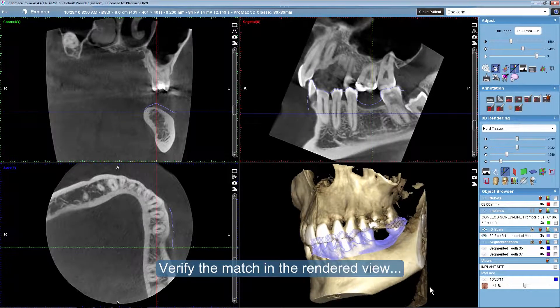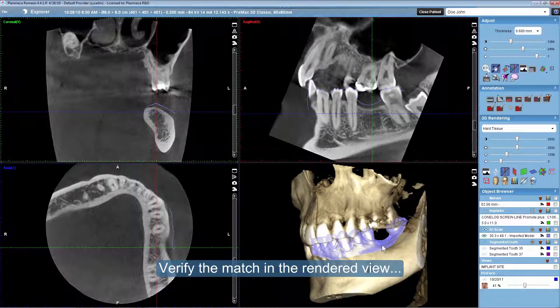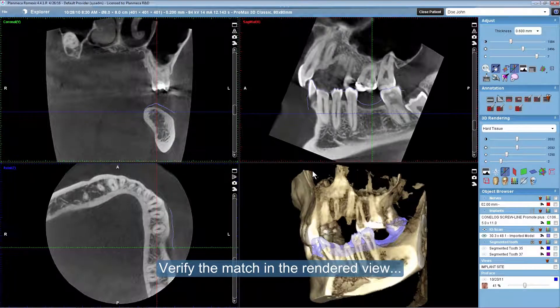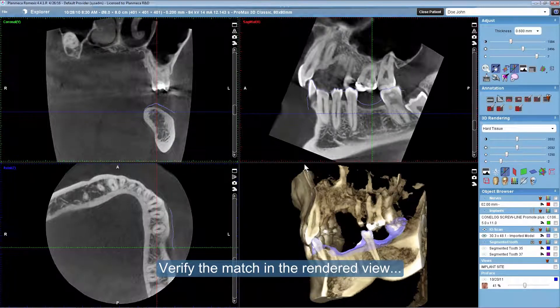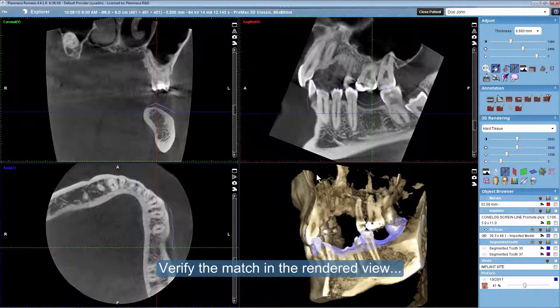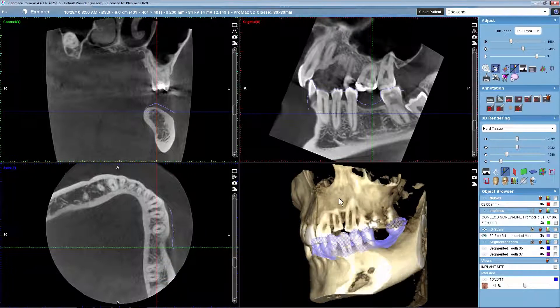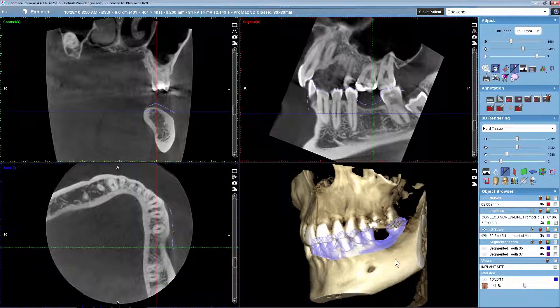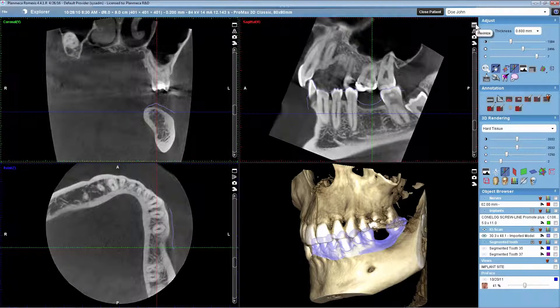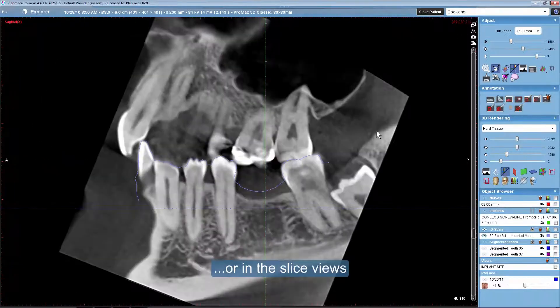Verify the match in the rendered view, or in the slice views.